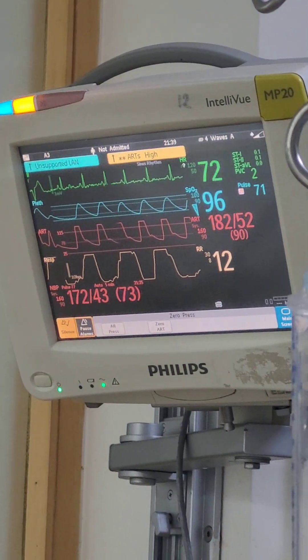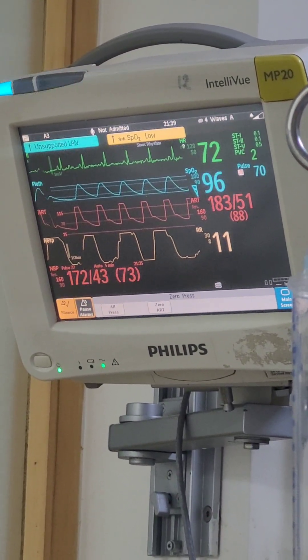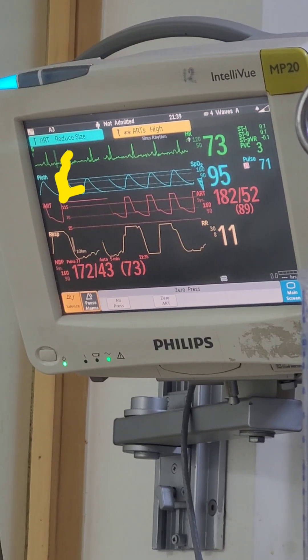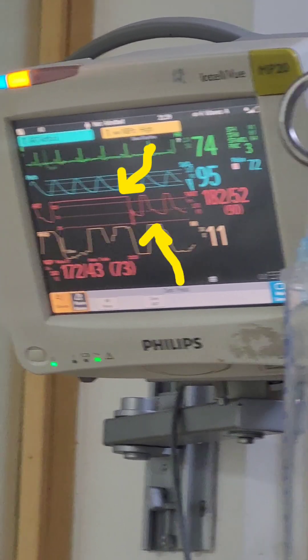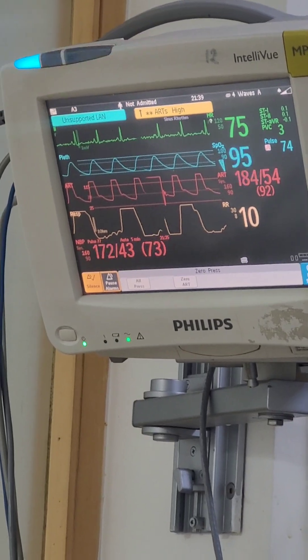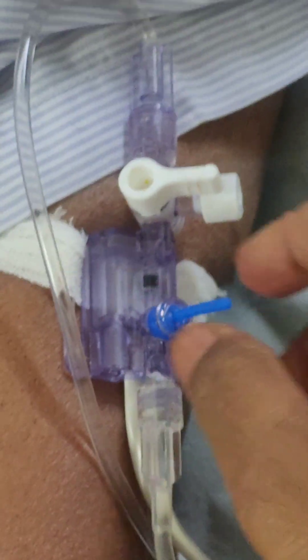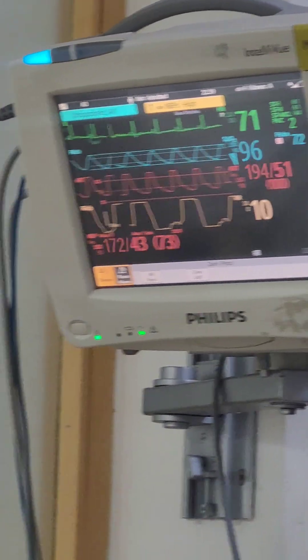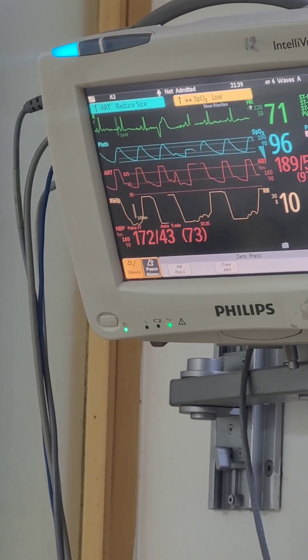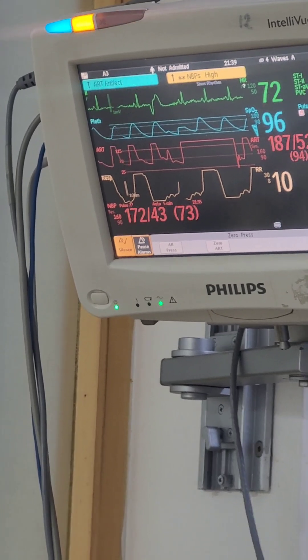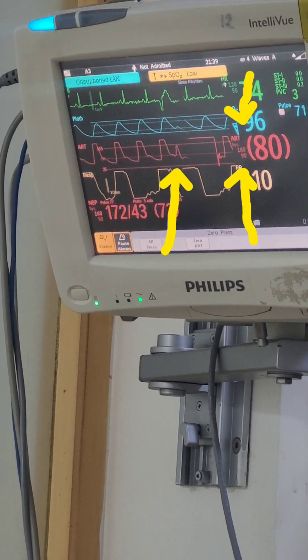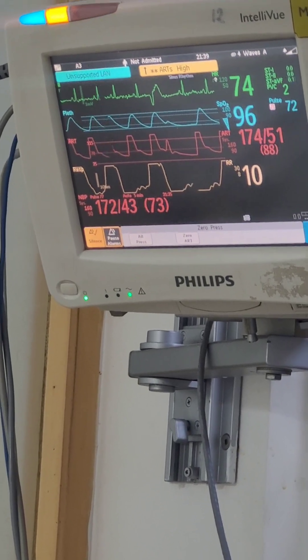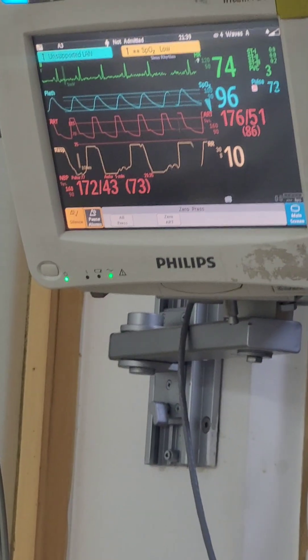I am doing the flush test or square test. So there was a square wave, and after that there was one oscillation. When you do this flush test and pull this string, you look at the square wave and then the number of oscillations — that tells you whether the system is under-damped or over-damped.